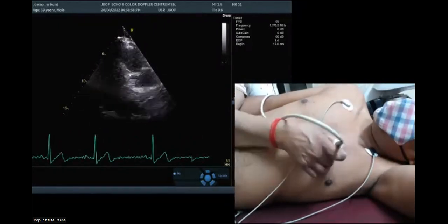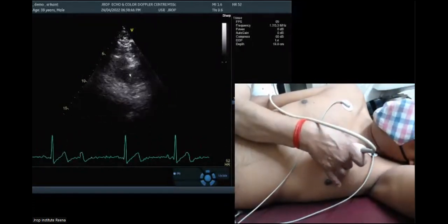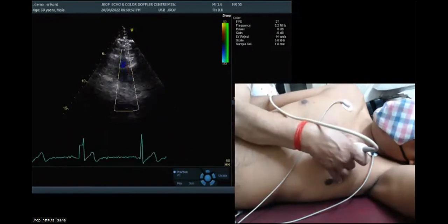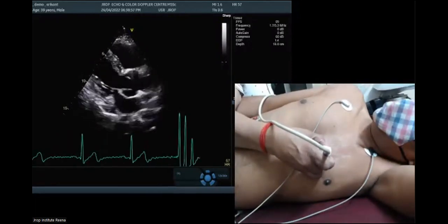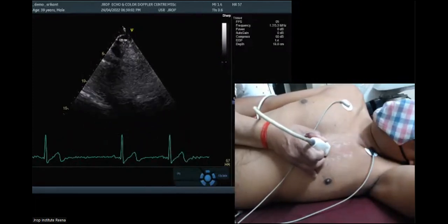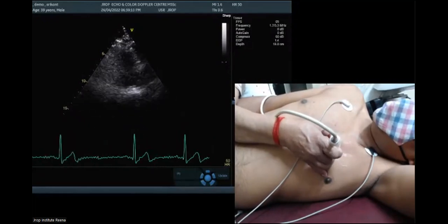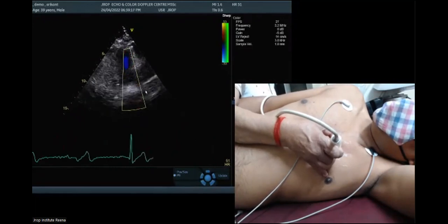Now look at the parasternal window. I'm going much above that, almost to the left first or second intercostal space. Here is the pulmonic artery. You can see the pulmonic artery. Or you can do this, Hiru. Make a parasternal window and let the footprint start looking toward the left shoulder. Then you'll find a ductal view. If the footprint is toward the left shoulder, then this structure, I'm switching on color. This is the pulmonic artery, and this will be the descending aorta.